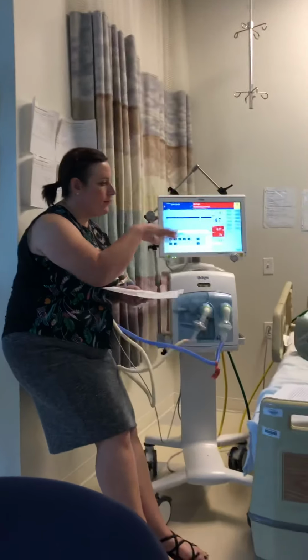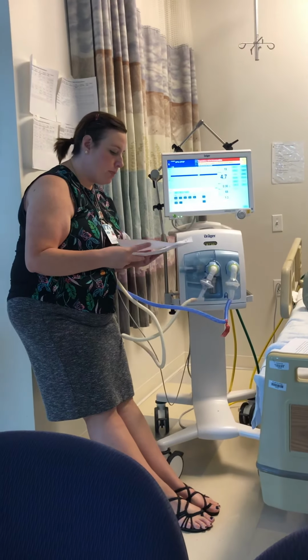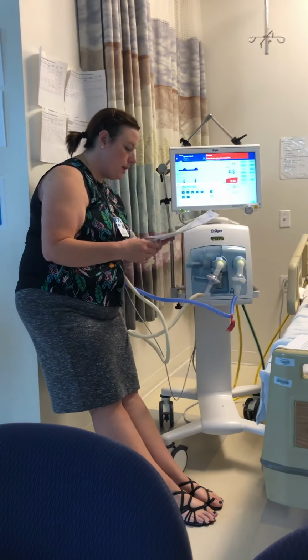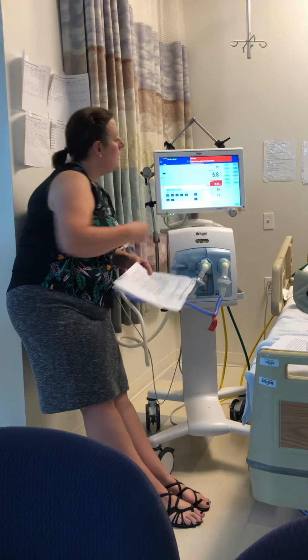So then we've hooked everything up that we need to hook up. We have identified the correct size of the nasal prongs. We've gone to the bedside, we've cleaned our hands, we've introduced ourselves to the family. Should just leave it in an apnea setting.